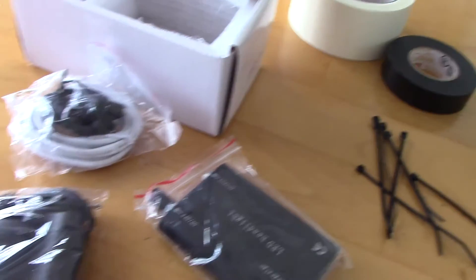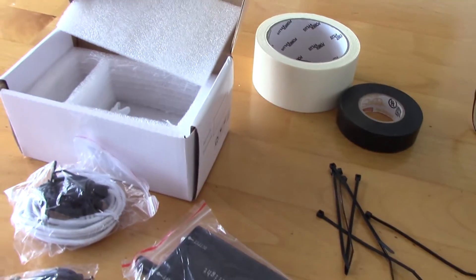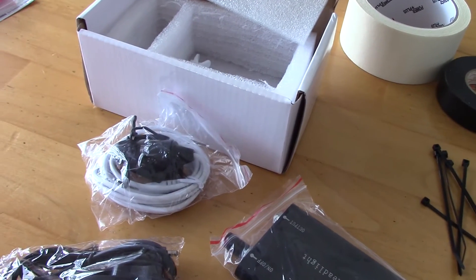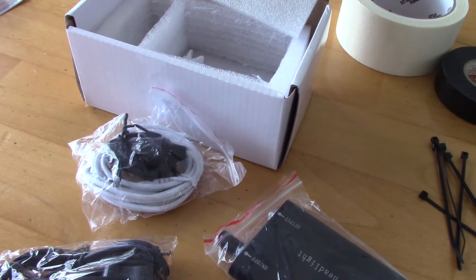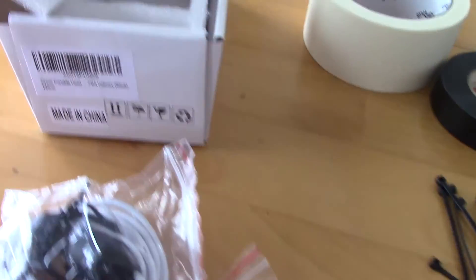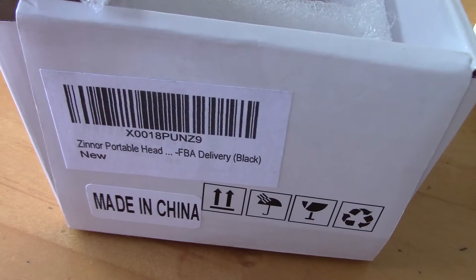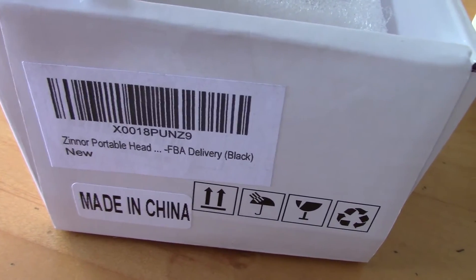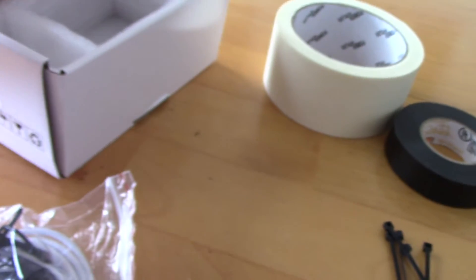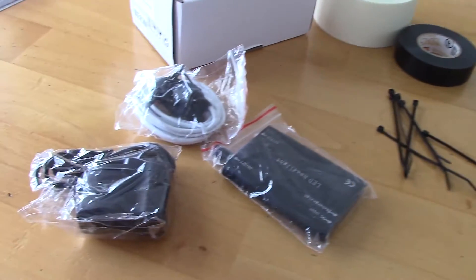Just search Amazon for 'surgical dental headlight' and you'll find lots of them. With Amazon Prime you get two-day shipping. You don't have to use this specific one — any kind will do, as different sellers are selling them. They're very inexpensive but excellent quality.